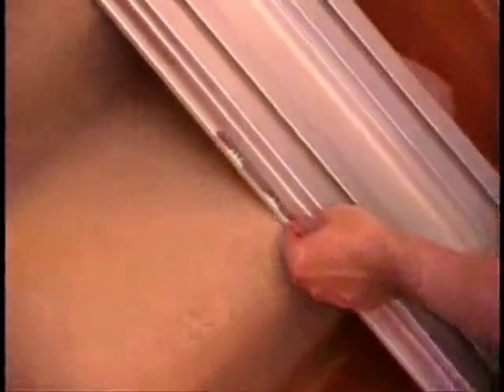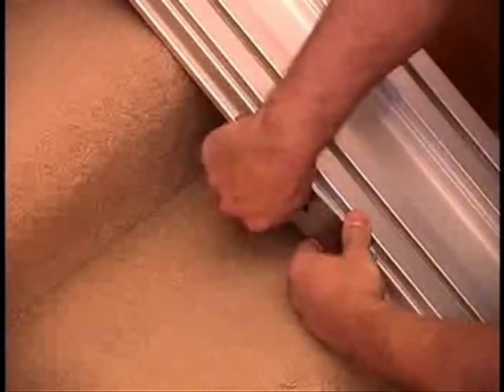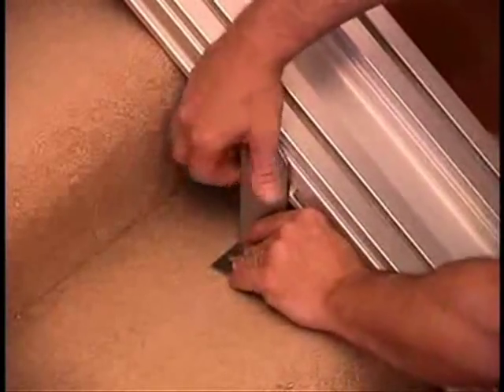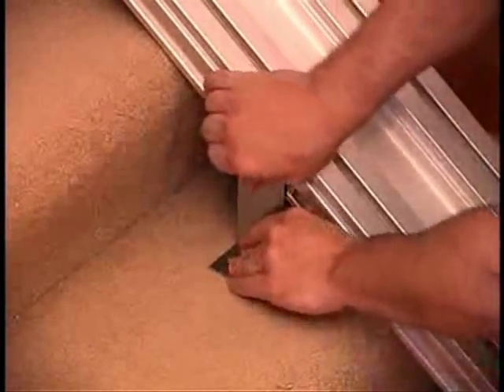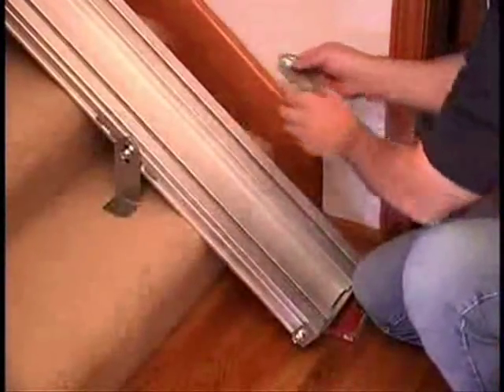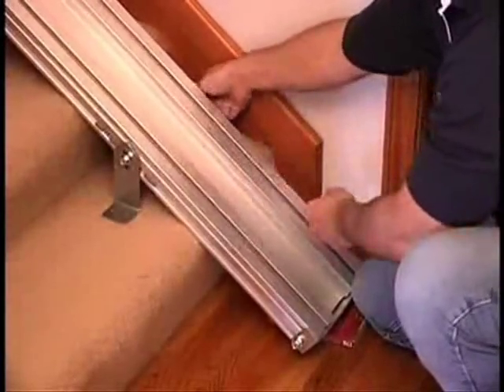Fasten brackets to the track channel on the bottom step and hand tighten. The bottom bracket gets installed inside the bottom nut. Leave the second to the bottom nut unused — it'll be used later. It's easier to do this with the track set out from the wall; it's easy to slide it up against the wall later.